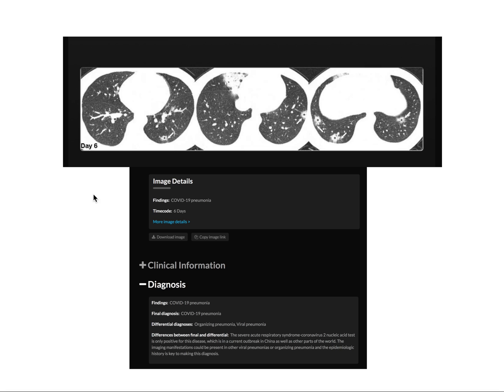Another case showing the organizing pneumonia pattern. You can see the round opacities which are again peripherally placed, with basal segmental involvement and no effusions — which is characteristic of coronavirus.